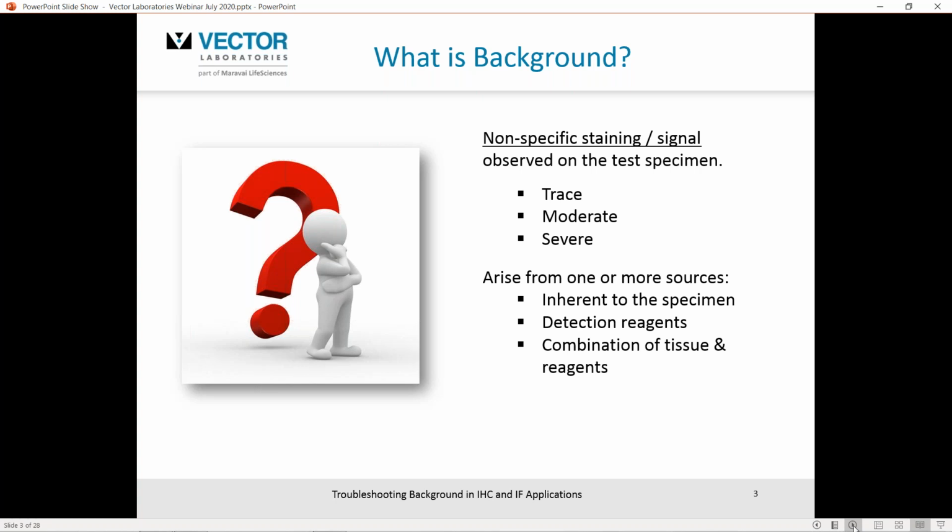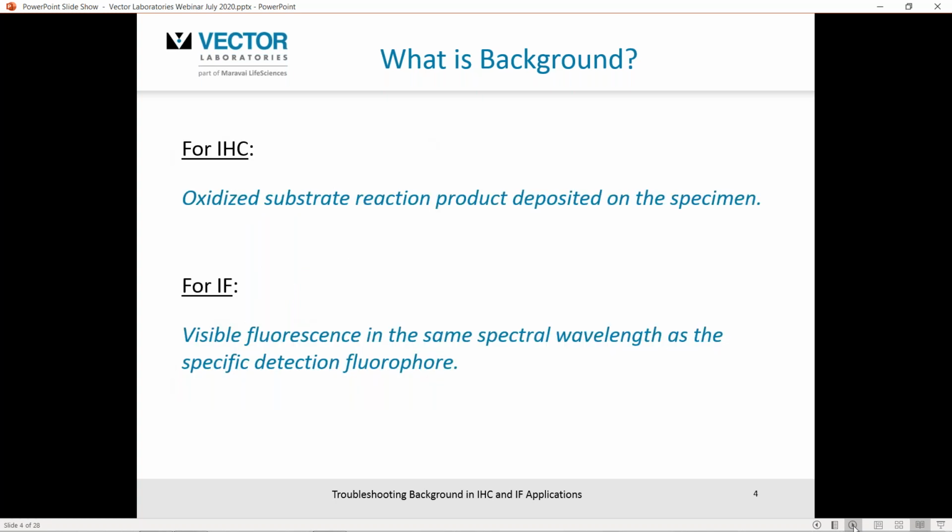Now, the background may come from one or more sources. Certainly it might be endogenous or inherent to the tissue specimen. It may arise from the detection reagents, or indeed it may be a combination of both the tissue and the detection reagents. So just to clarify, for immunohistochemistry, we're speaking about the oxidized substrate reaction product that's deposited on the tissue specimen. For example, this would be diaminobenzidine staining, or DAB staining, that you observe in a non-specific manner. For immunofluorescence, we're referring to visible fluorescence in the same spectral wavelength as the specific detection fluorophore. For example, if you're working with a fluorescein or FITC conjugated green fluorophore, you may also see some interfering green fluorescence in that same wavelength.